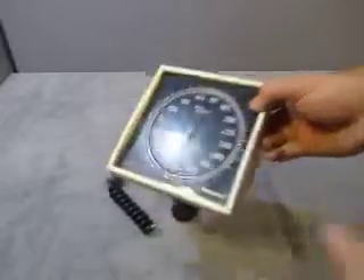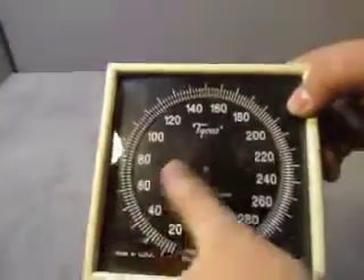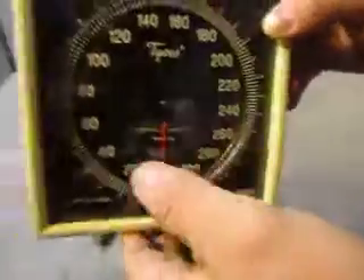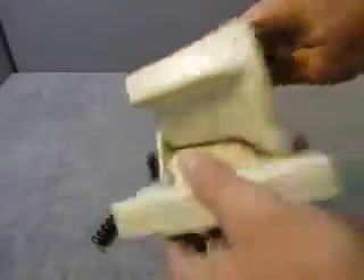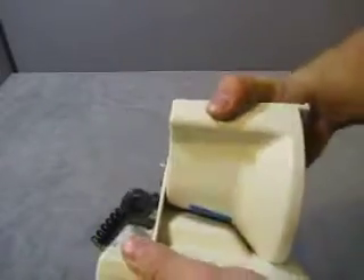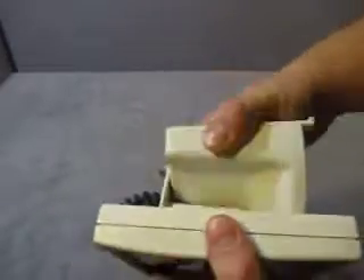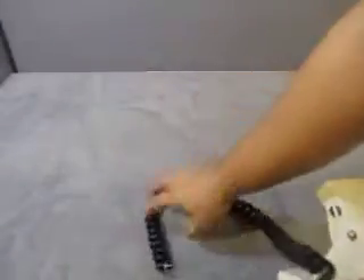Up for auction we have a Welch Allen blood pressure gauge with hose and cuff holder. As you can see, there are a couple scratches on it. Here's the cuff — it goes in there — and it mounts to the wall. If it's mounted on the wall it probably works a little better.